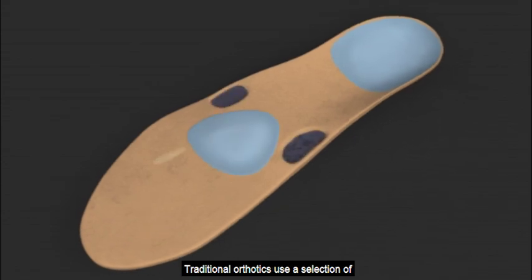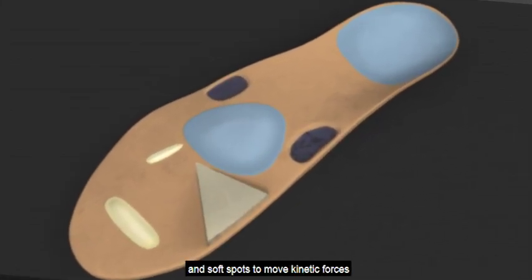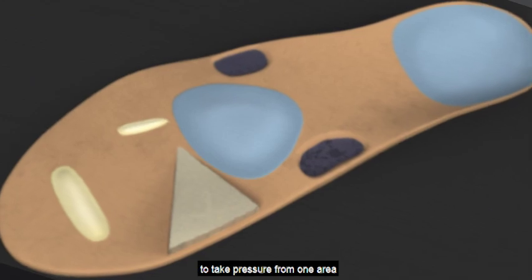Traditional orthotics use a selection of lumps, bumps, tilts, skives, grooves, flanges, and soft spots to move kinetic forces around the bottom of the foot — to take pressure from one area to another.